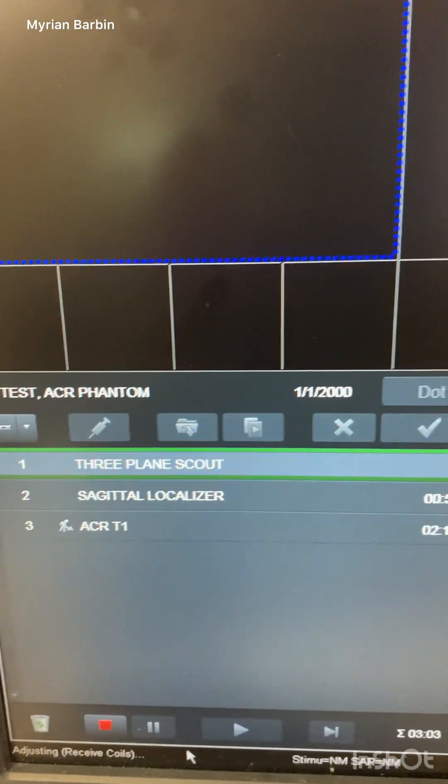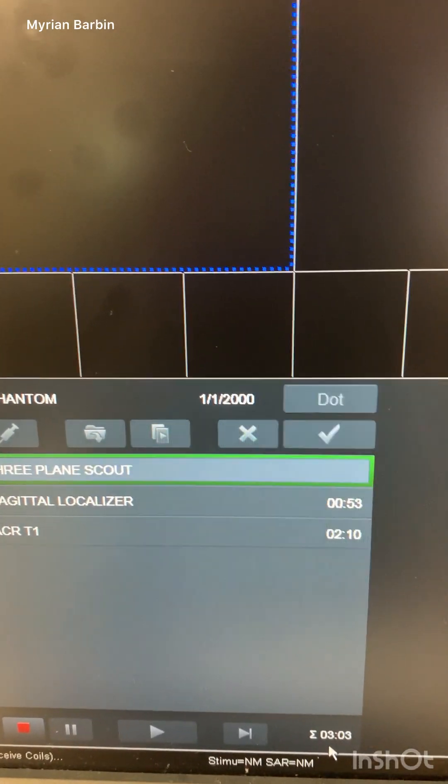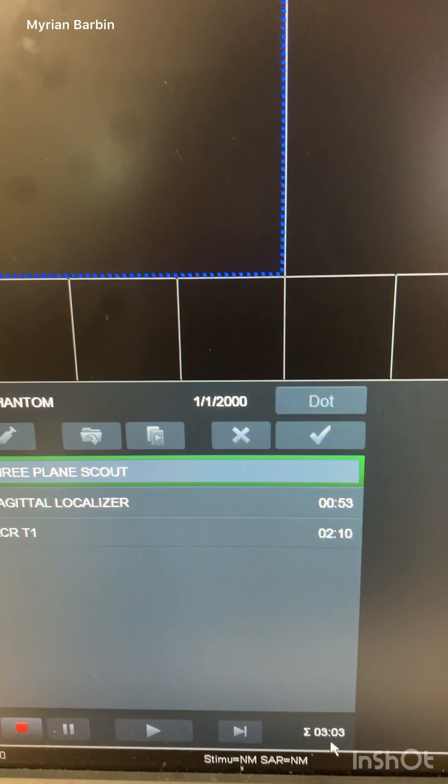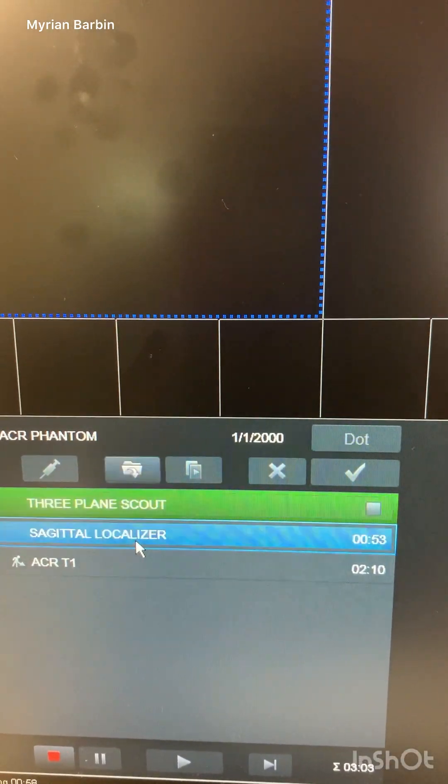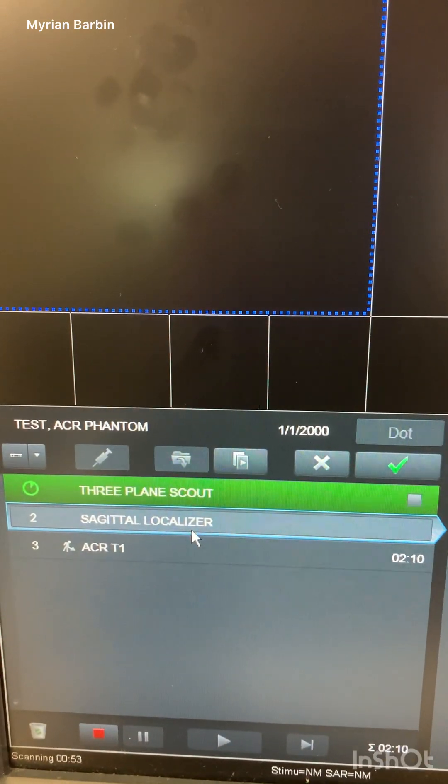The three-plane scout is coming up now. It takes about a minute to perform. After it completes, I'm going to go ahead and pull up the sagittal localizer.